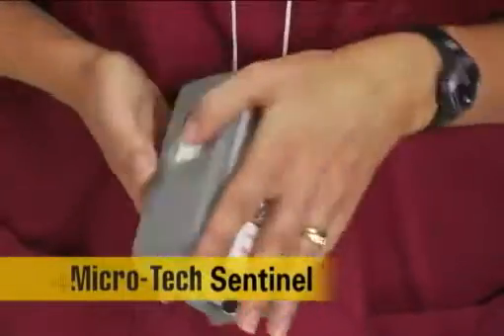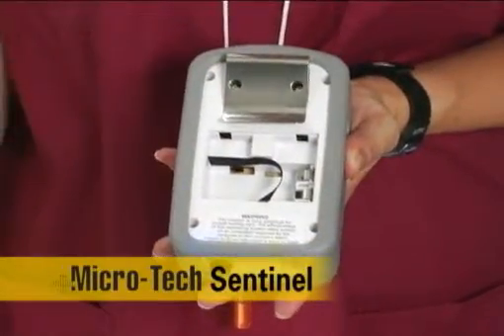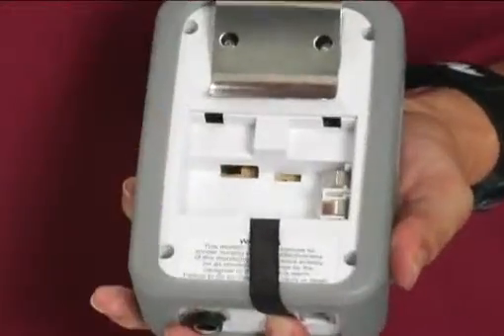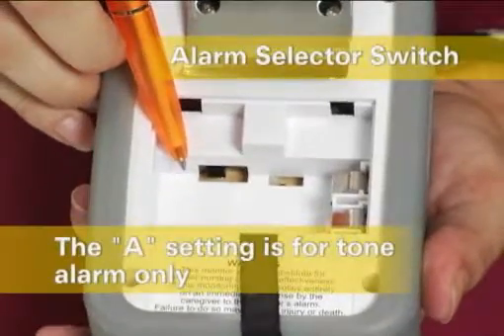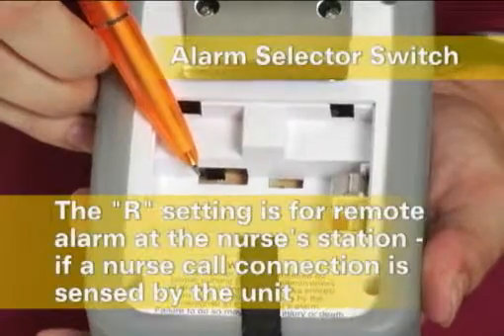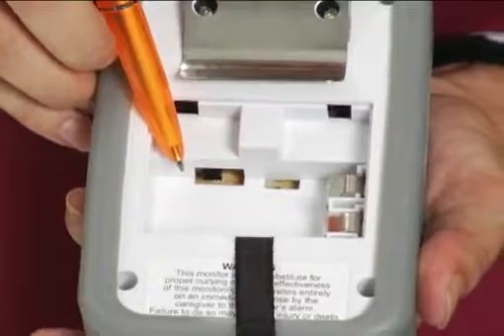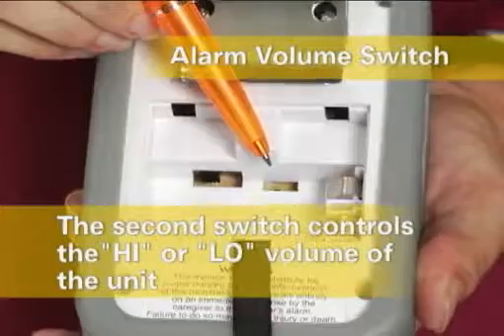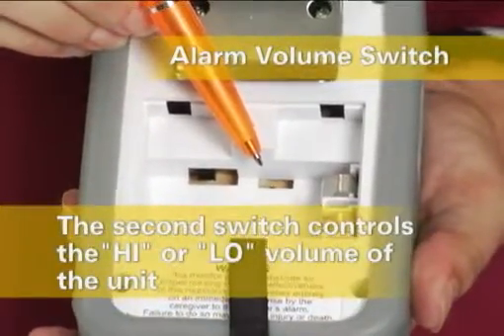Turn the unit over. Using your fingernail, pull back on the battery cover and remove it. Inside you will find more controls. On the Microtech Sentinel, there are two switches. The alarm selector switch is labeled A and R. The A setting is for tone alarm only. The R setting is for remote alarm at the nurse's station if a nurse call connection is sensed by the unit; otherwise, the alarm will default to the tone alarm. The second switch controls the high or low volume of the unit. You can use either setting depending on your preference or facility protocol.